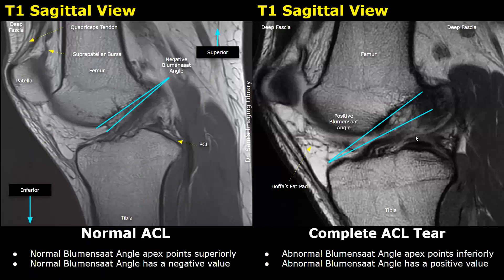Now we will look at the Blumensat angle in this case. The Blumensat line is drawn along the margin of the lateral femoral condyle, and the second line is drawn along the ACL margin. These two lines are meeting at this point. This is the Blumensat angle — the apex points inferiorly and will have a positive value.